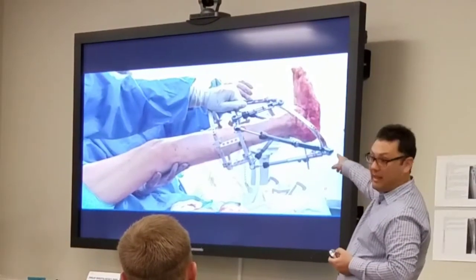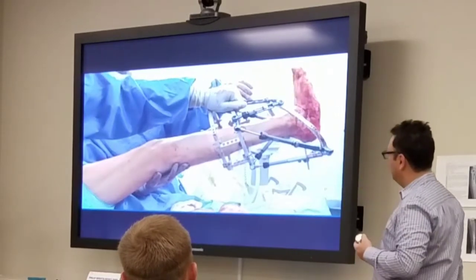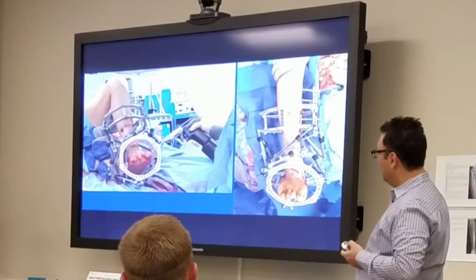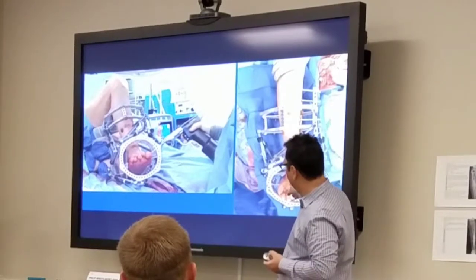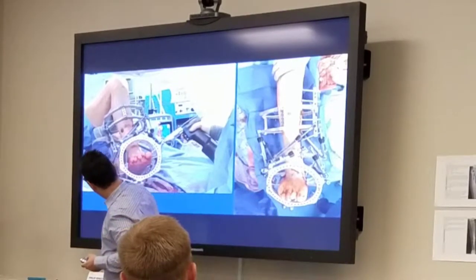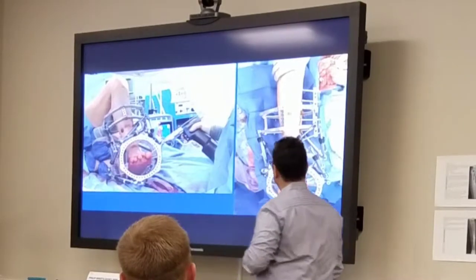Now, he also had a lot of equinus. I got that posterior big screw, the big rod in there. Then I placed in the foot portion. So you can see here, you got your miter, so you got your foot, the calcaneus placed at a 45 degree angle, and then you got your leg.